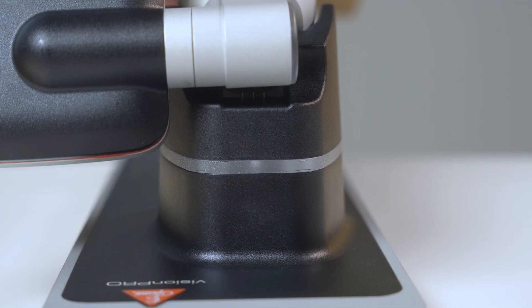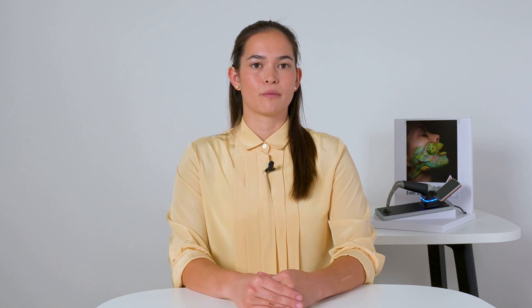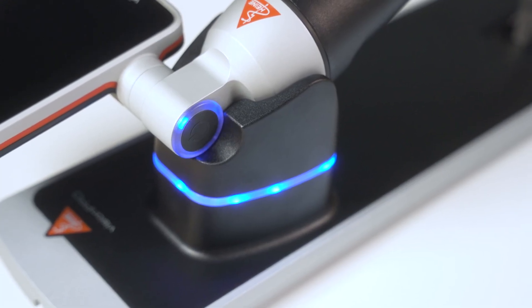Even when the charging station is connected to the main supply, only when the Vision Pro is inserted does the station recognize the device and start to provide electricity over the contact pins. Therefore, users can be sure they will not accidentally cause a short circuit or any other damage while cleaning.